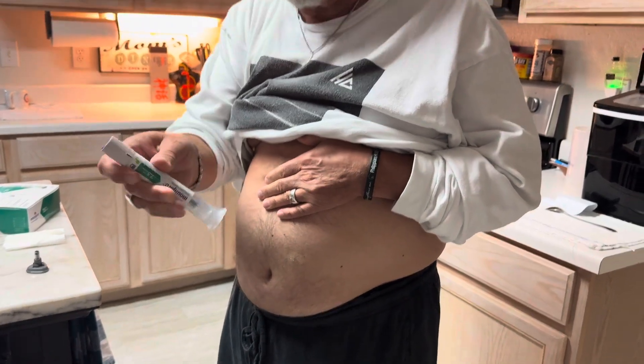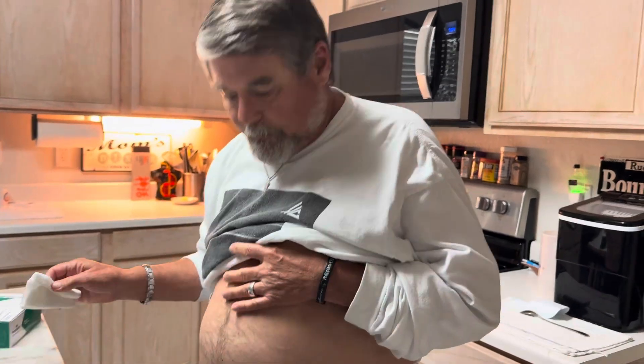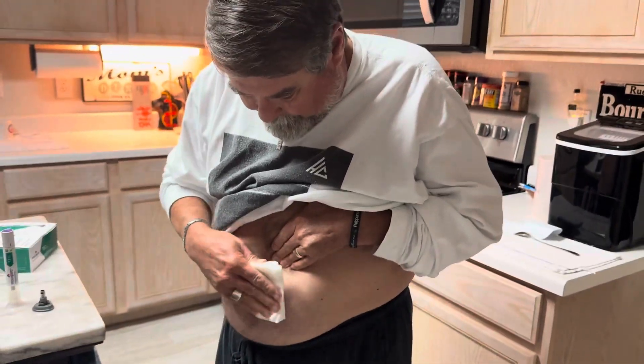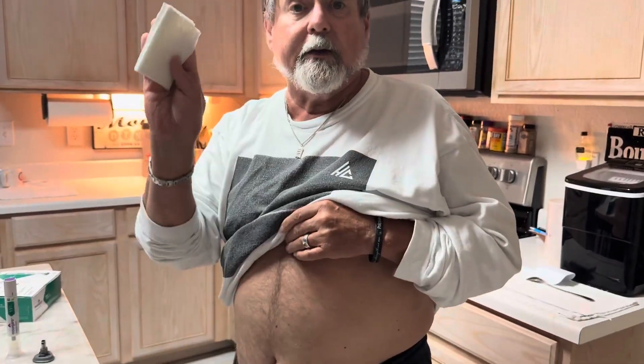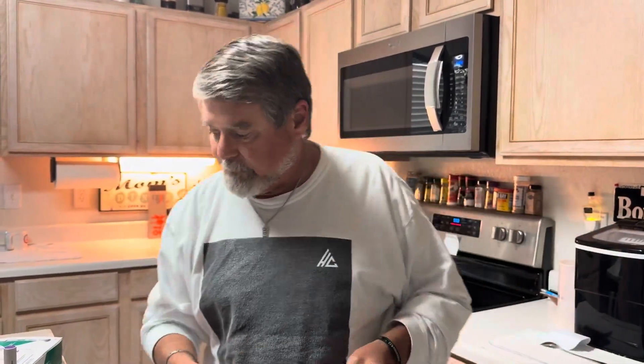Here we go — first click... second click. That's all there is to it. Sometimes there's a little bitty pinprick. Look — no pain, no gain baby.